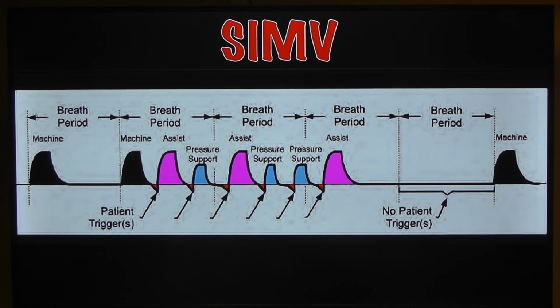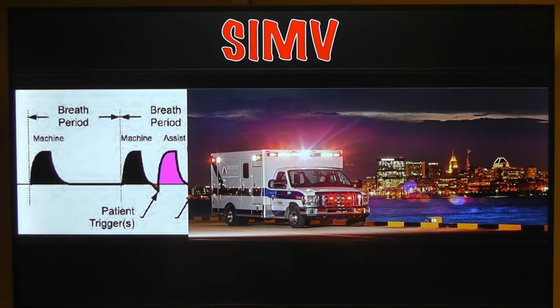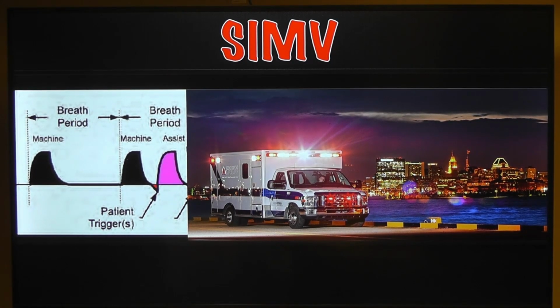Okay? So each one of those breaths so far, what mode is that so far? Patient-initiated, machine-initiated breaths, all the same breath, AC. So up until that point, that's an AC mode. Okay?